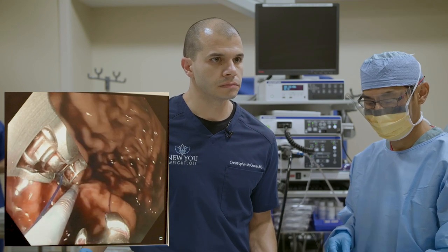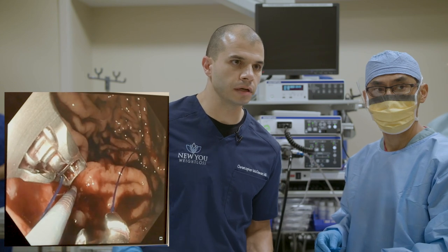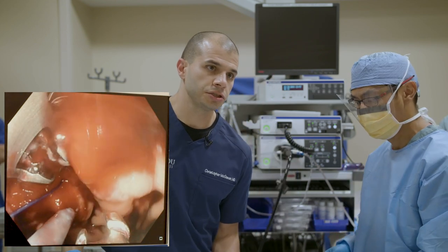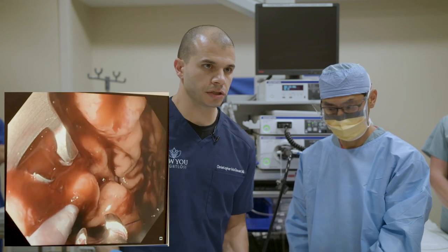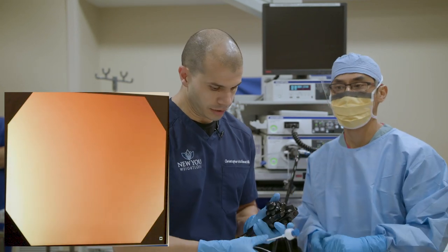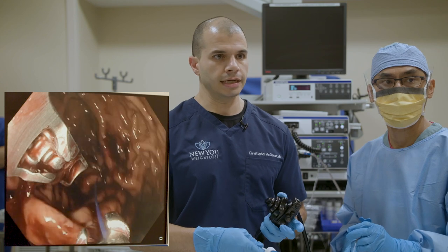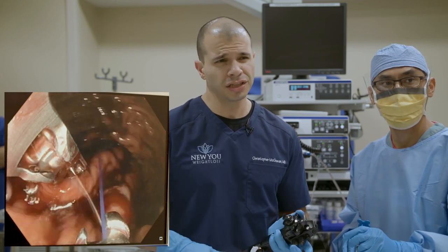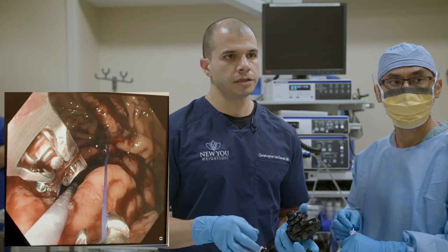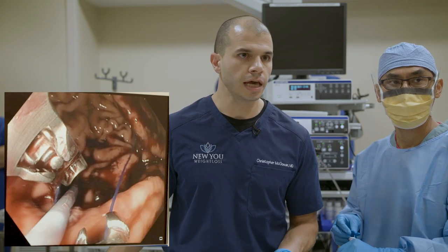Question from Julie: what is the percentage of restriction failure after a month? It depends how you're defining restriction failure — there should not be a failure of restriction at a month. The stomach's swollen and really tight right after this, and that swelling goes down over the first couple of weeks, so the feeling of restriction may be different. But the sleeve is still fully intact at that point. For some people there's a very clear fullness — eating one bite too much and getting immediate feedback — for others it's a more subtle indigestion-type feeling. It really varies from person to person.